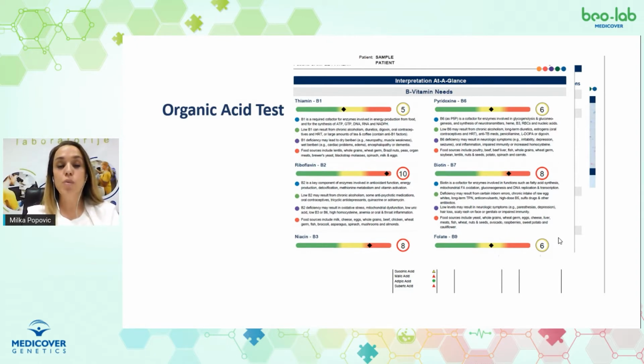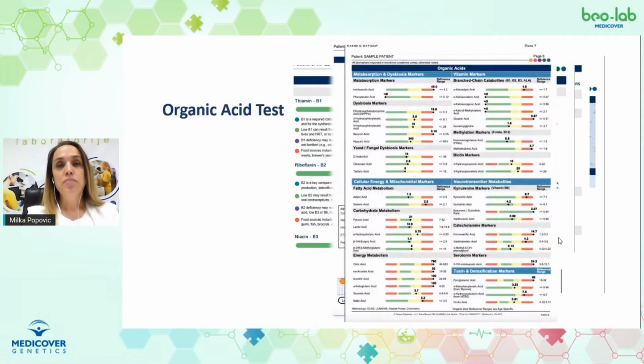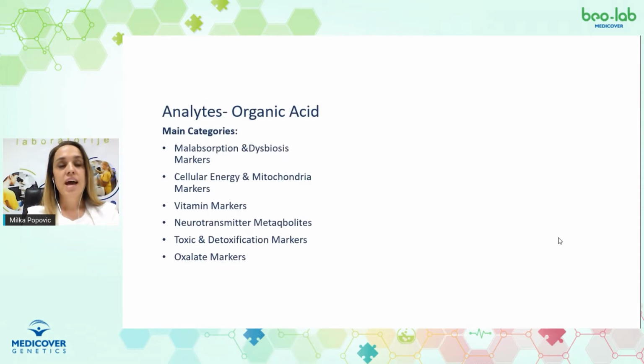On the next pages, you have several pages such as these in the report, and they show you a summary of the general needs for each nutrient. They are more educational and are important for the patient because they point to the level of importance of each nutrient and where these nutrients can be found in which particular foodstuff. Now, this is how the whole sample and findings look, but we'll obviously go into more detail later on.